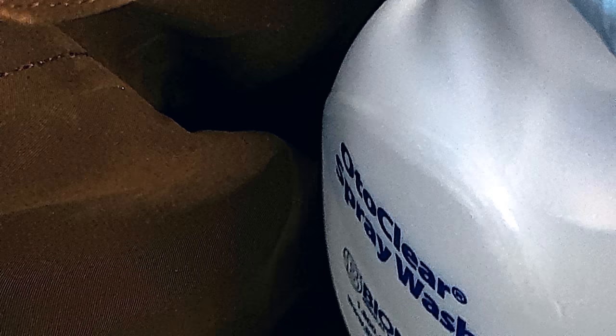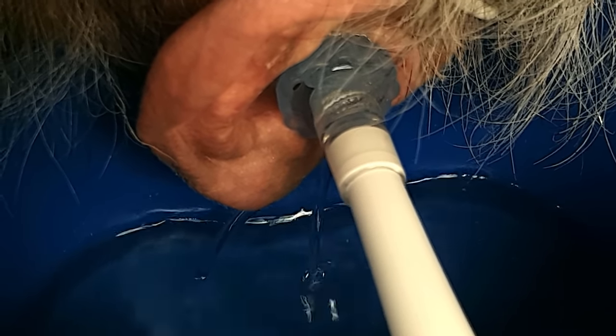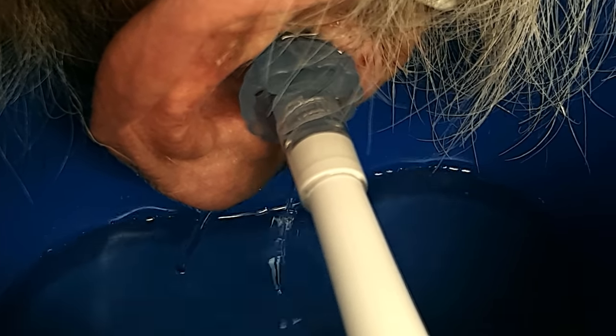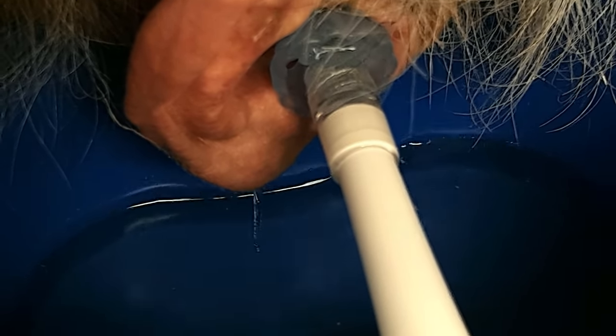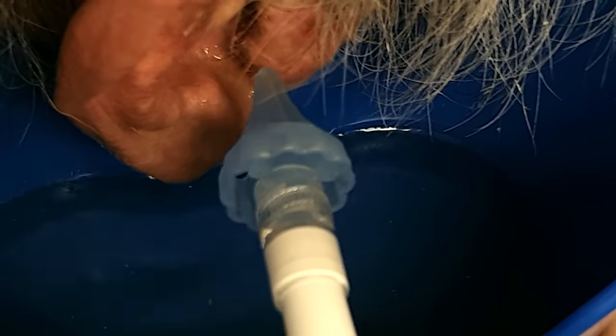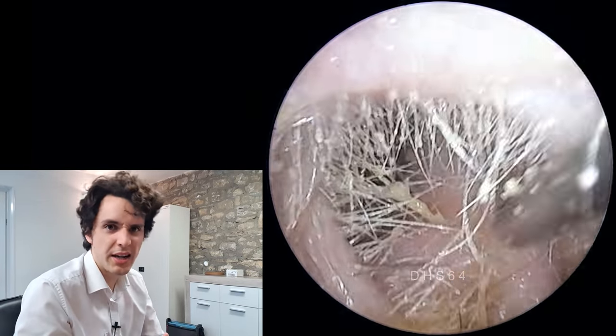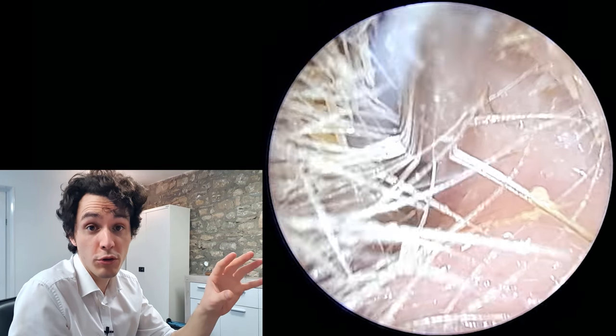Whenever we talk about irrigation or syringing, we tend to have negative connotations with that, particularly if a patient has had their ear syringed with the old-fashioned big metal syringes with a huge plunger, which is definitely dangerous. But that's fallen well out of favour now in the UK — it's almost unheard of. You would normally see patients having their ear irrigated with a manual method like this, which is low pressure, or an electronic irrigator — a little machine with a gun on the end that pulses water into the ear.